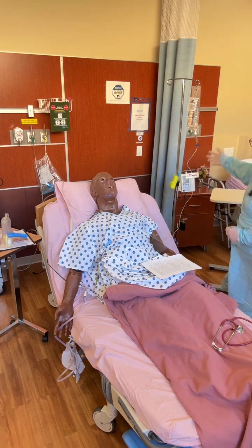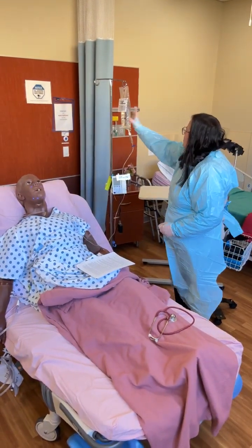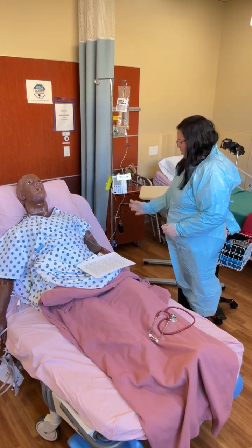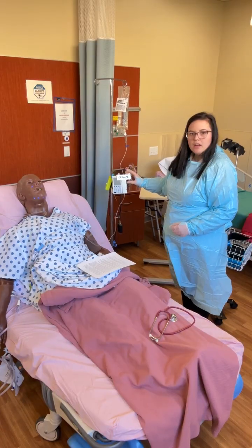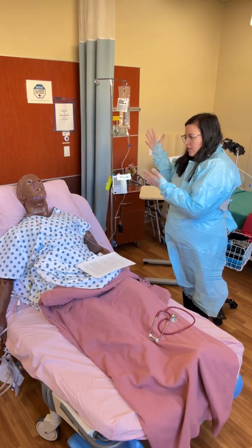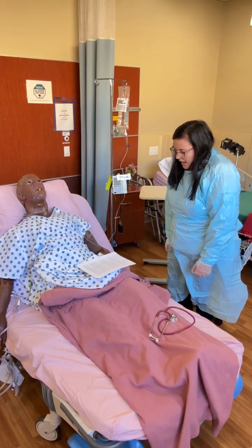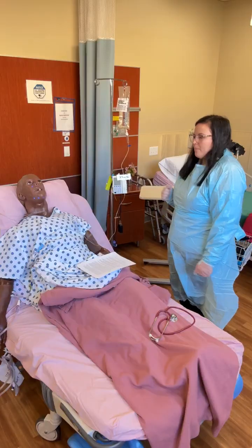This IV pump, when you see it here, you should be good. You see that this has the bag, it's spiked, it's hooked up, and it has a sticker on it that says 125 mLs an hour. That in sim world means that you have a hooked up IV and it is running. If you needed to change the rate for some reason, you would have to stop the IV pump.